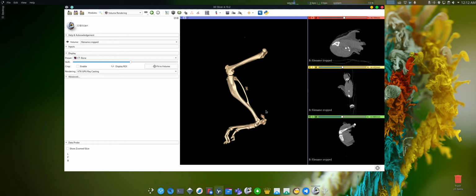There are different types of analysis possible, but many of them will involve segmentation of a specific region or volume of interest from the whole image. So this will be a universal procedure that can be used for other applications. First, we'll change the volume rendering.